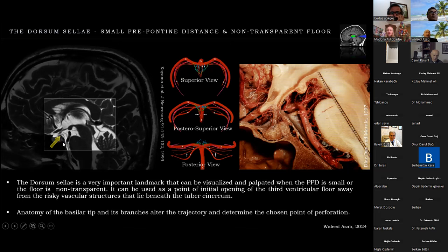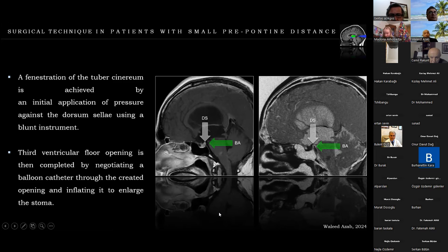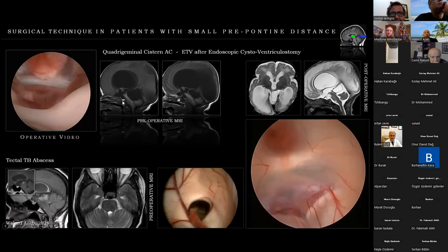On this MRI, the dorsum sellae can be observed in the sagittal view, and in this anatomical specimen it is present at the top of the clivus posteriorly and in very close apposition to the floor of the third ventricle. The technique involves fenestration of the tuber cinereum by initial application of pressure against the dorsum sellae using a blunt instrument, then opening the third ventricle floor by negotiating the balloon catheter through the created opening and inflating it to enlarge the stoma.